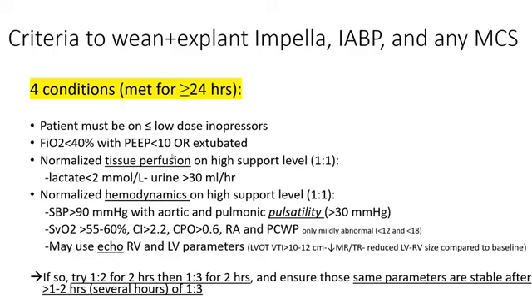Now there is always a debate: should we remove balloon pump or Impella before extubation, or should you extubate before removing them? Both ways are okay. There are arguments for both. There is value in extubating the patient while balloon pump is still in, because during extubation, you get significant rise in pre and afterload.